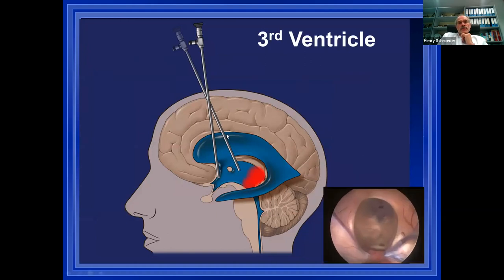That I was mentioning already, if you have a tumor in the posterior part of the third ventricle and hydrocephalus, you want to make an ETV and to take a biopsy. In this case, when the foramen of Monro, and you see it on the pre-op MRI, is large, then we put the borehole not ideal for the ETV. That means in front of the coronal suture, we go 2 centimeters in front. And then you can reach both of these regions without damaging the fornix.